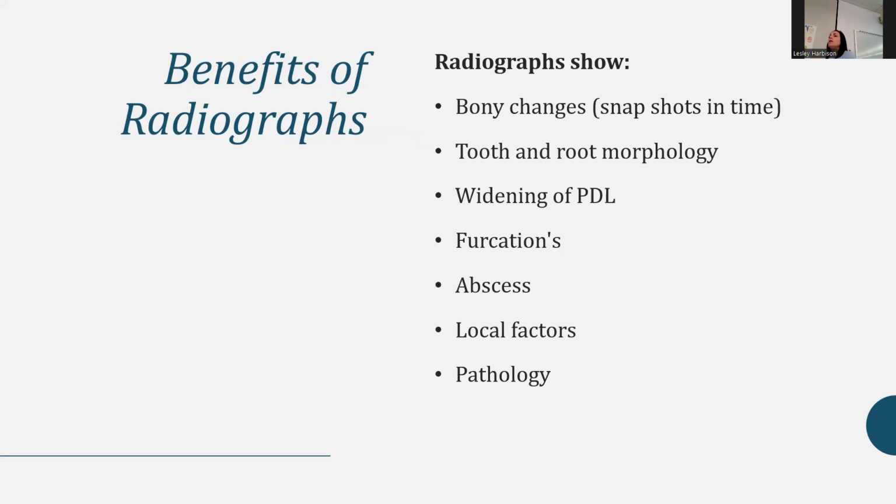Benefits of radiographs: you do see the bony changes when you can compare radiographs. So there are multiple snapshots in time. And if they're at the same angle, then that consistency is there because you took them at a similar angle.